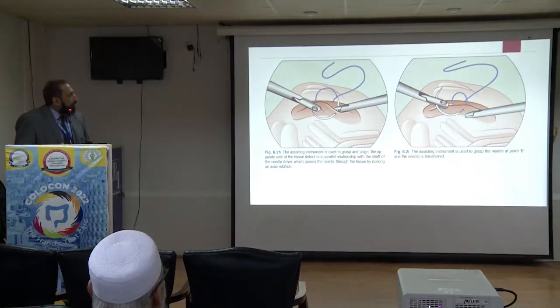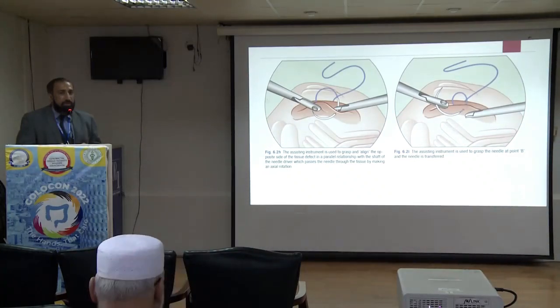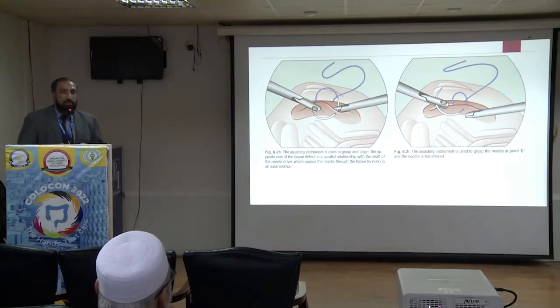In the fifth diagram, we repeat all the sequence on the other side: lifting the tissue with the help of the assisting instrument, aligning the needle holder with the tissue, passing the needle through the tissue, following axial rotation of the needle holder, and again grasping the needle with the assisting instrument. These are all the steps and the principles which should be followed when we are reapproximating the tissue.